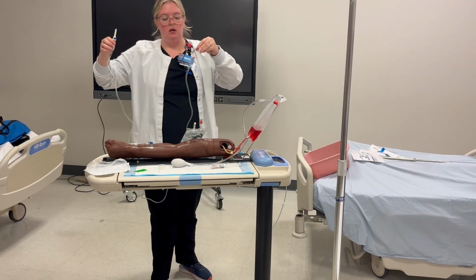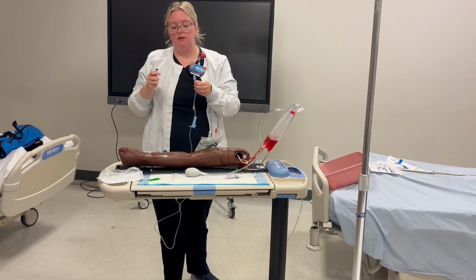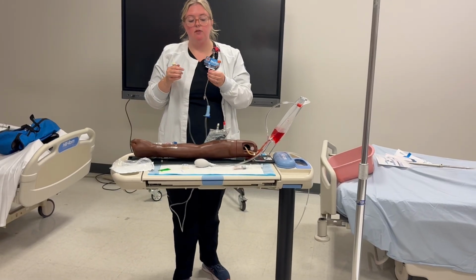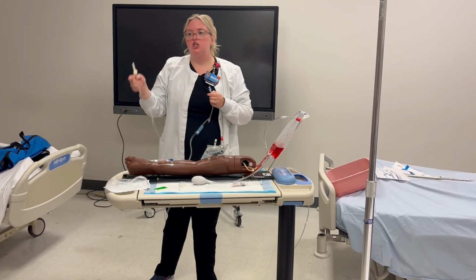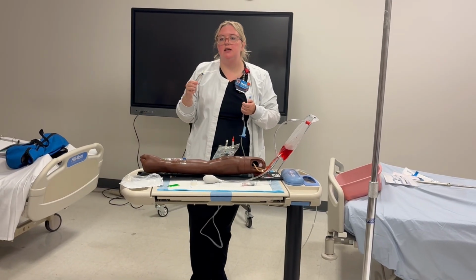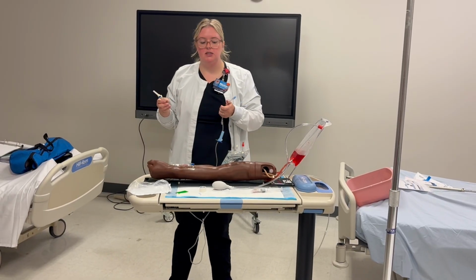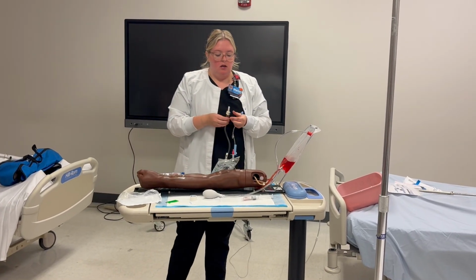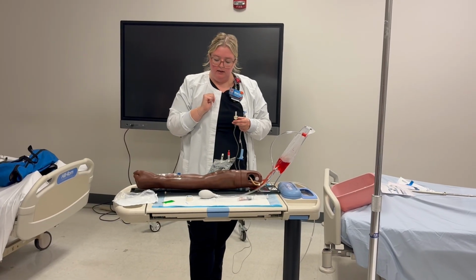So, I'm going to keep the cap on. In real life, actually I'm gonna take it off in here. In real life, this will prime easily with the cap on. Once you guys start reusing it, it does not prime so easily. So since you guys will be reusing, we'll start with fresh supplies on the day of, you still will be reusing it. So you're going to spike and then remove the end, and then you have to be careful of the end.